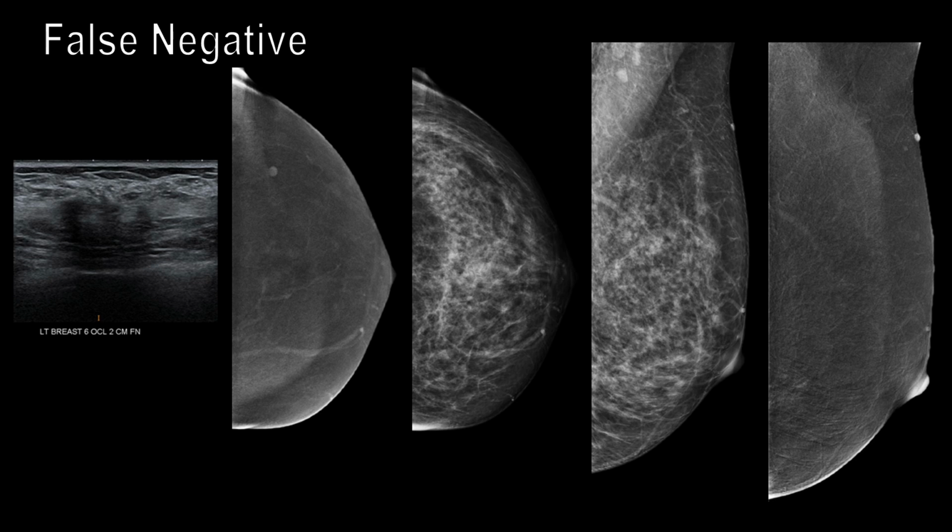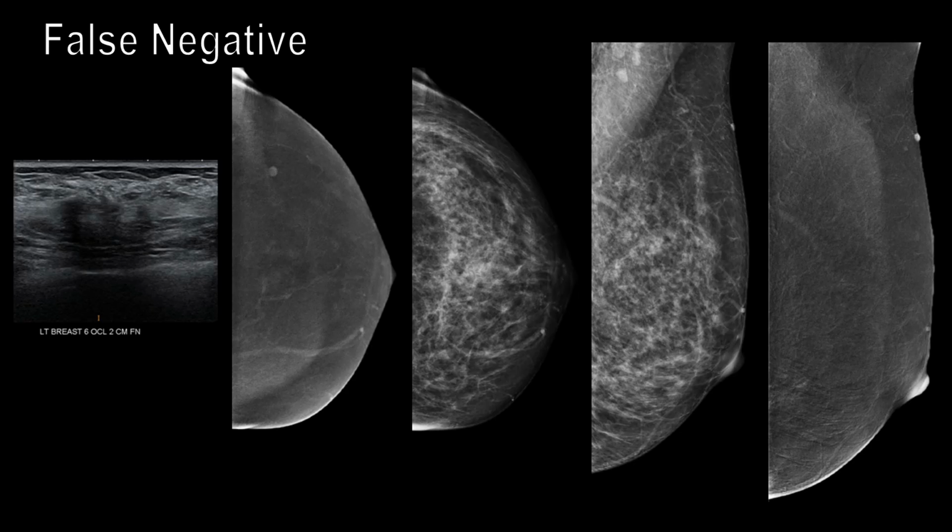There are definitely false negative exams with contrast-enhanced mammography. Luckily, these are low-grade malignancies, more so DCIS and more so lobular type of low-grade malignancy, usually not the high-grade. In this case, the patient had an ultrasound for her palpable lump. You can see that there is an obvious abnormality on ultrasound. It is very difficult to see any abnormality on the contrast-enhanced mammography exam. And really, just because we know that there is an abnormality on ultrasound, we see a minimal area of non-mass enhancement there.